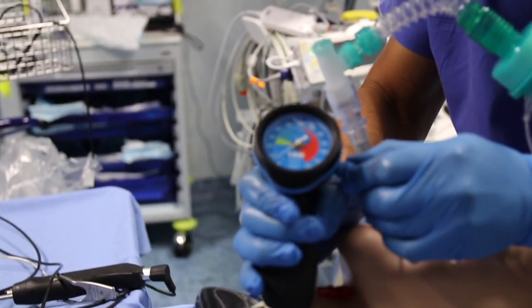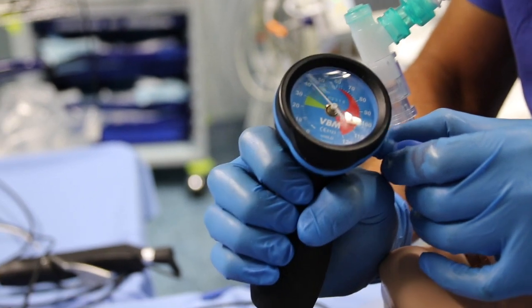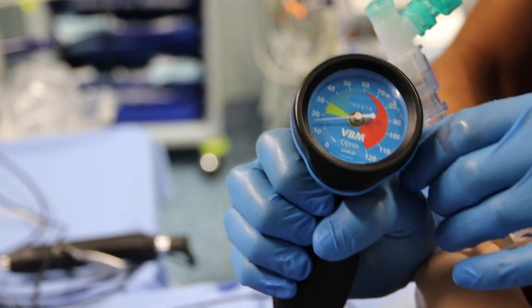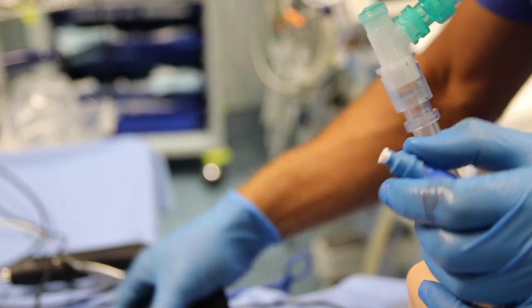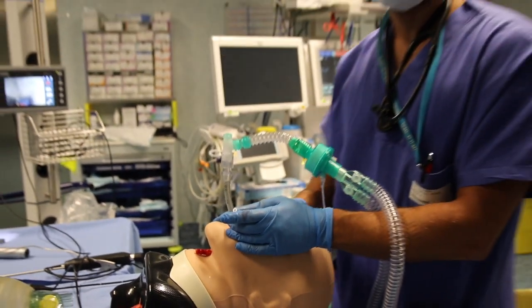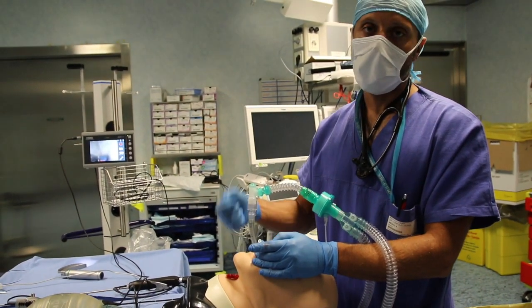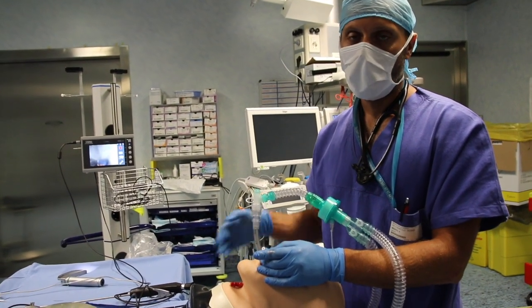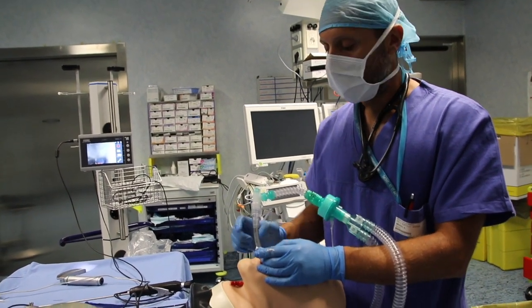Close the T-mount and reinflate the tracheal cuff with a pressure gauge to the volume level suitable for the trachea. We've just intubated the patient practically without any apnea phase. At this point, if the case requires it, you can deflate and remove the esophageal cuff in order to free the gastric pathway for an esogastric tube. Thank you.